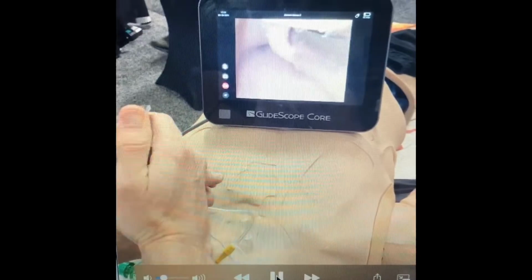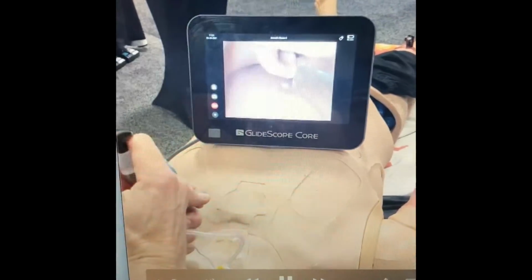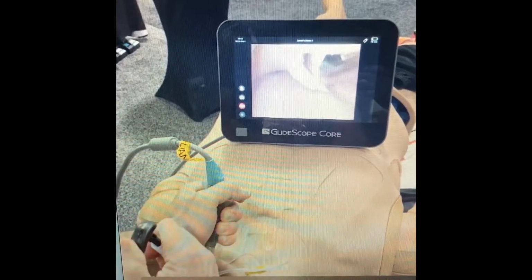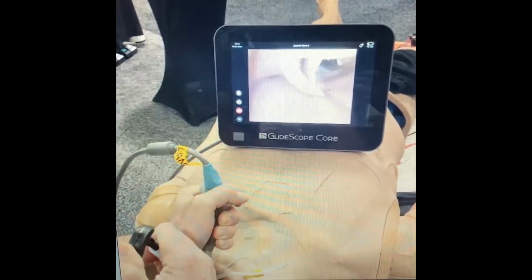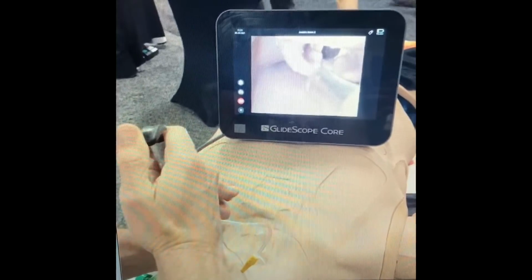Watch this manipulation of the tube. As you can see, you move it left and right all you want to. If you're down low, you can move it up and in. This is actually a good video also, just to note that there are people walking around, there's commotion going around, and your job is to keep a steady eye focused on the screen, not watch what's going on all around you, because this is going to be very common.